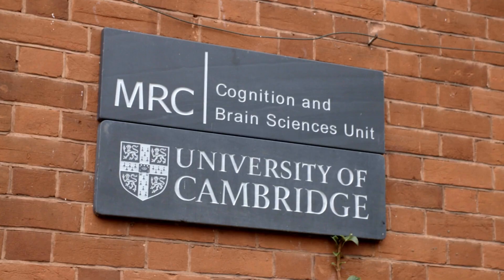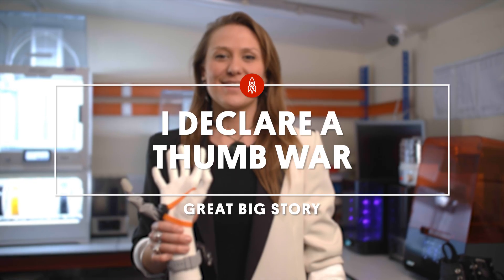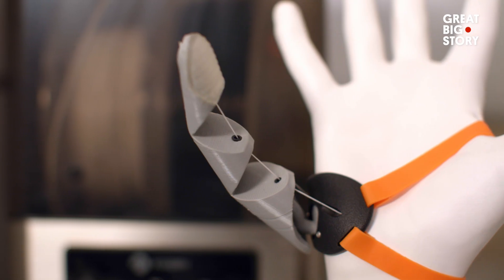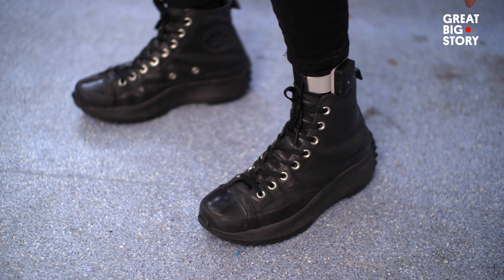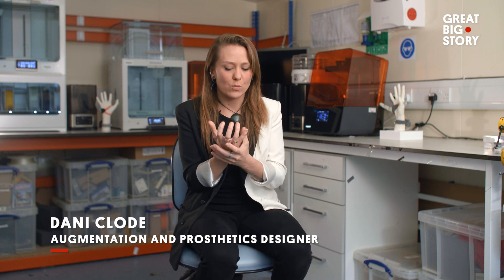We went to the University of Cambridge to find out what amazing things we could do with it. The Third Thumb is a 3D-printed extra thumb for your hand, controlled with your toes. I was really trying to investigate the relationship between the wearer and a prosthetic — to feel what it was like to be in control of something I was wearing, with proportional control responding to my movements.